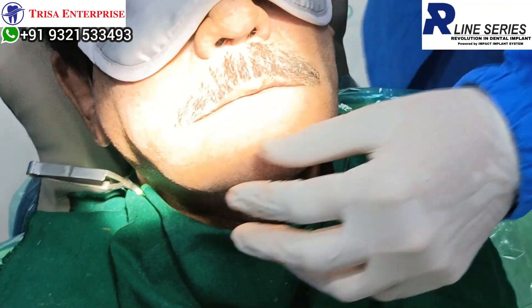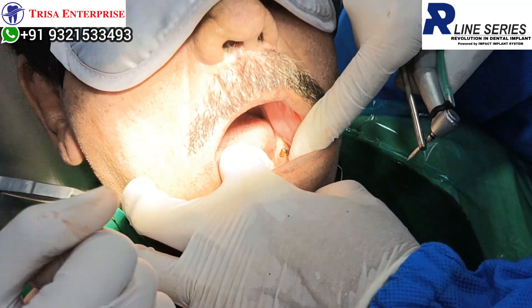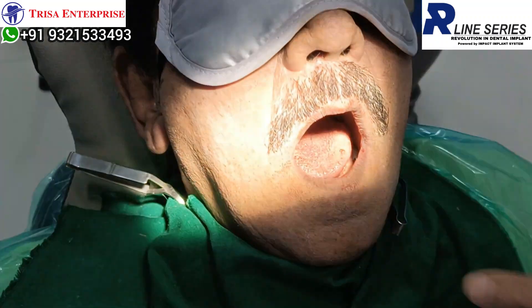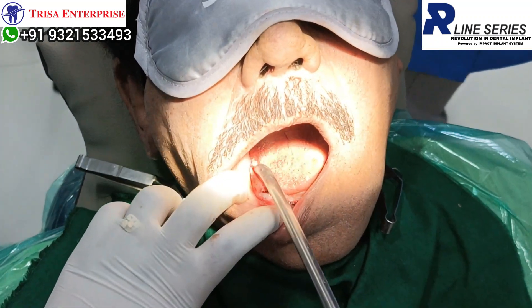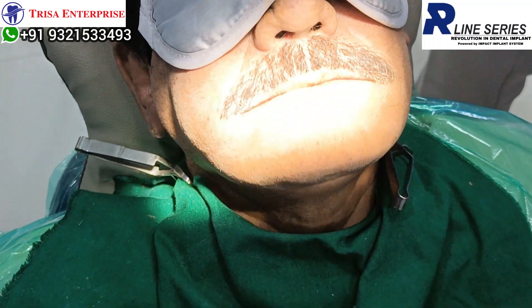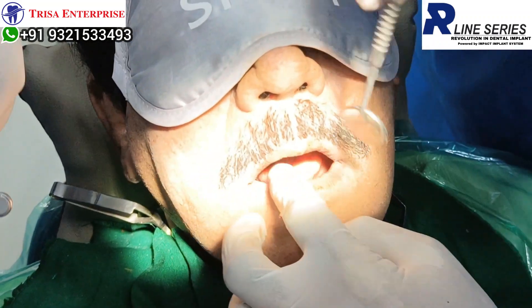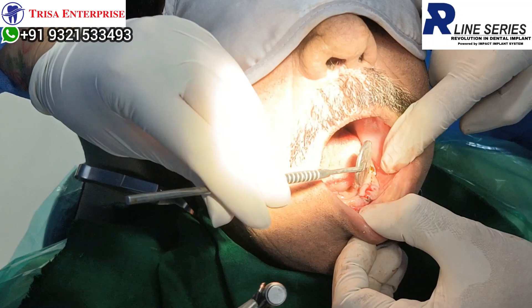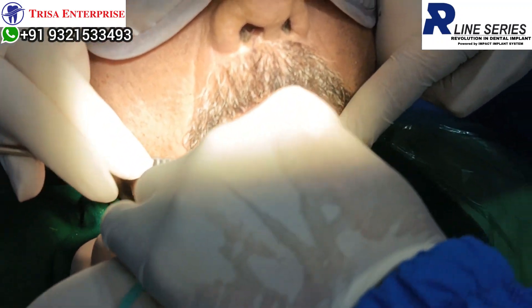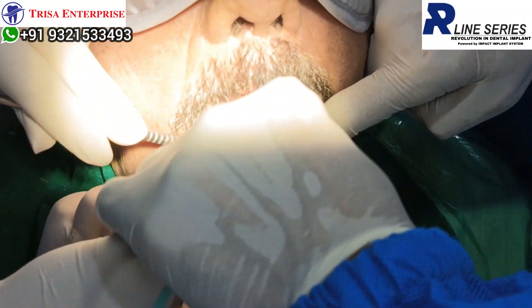I want to make you do lingual perforation also. Let me place the implant, then you can just hold on here. So we have placing — hold the retract with the thumb. Replacing here. Next, just this side here. So you palpate the anatomy, get some idea about the anatomy — all you need to do is go straight now.